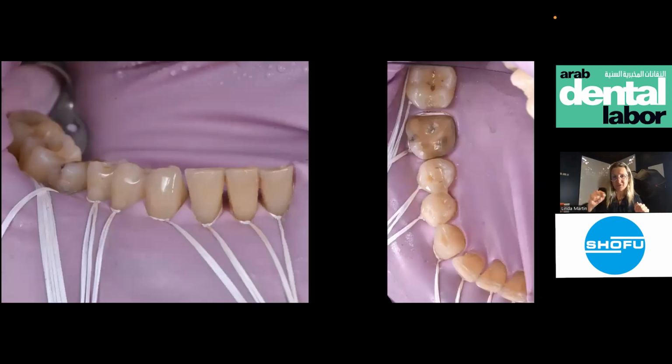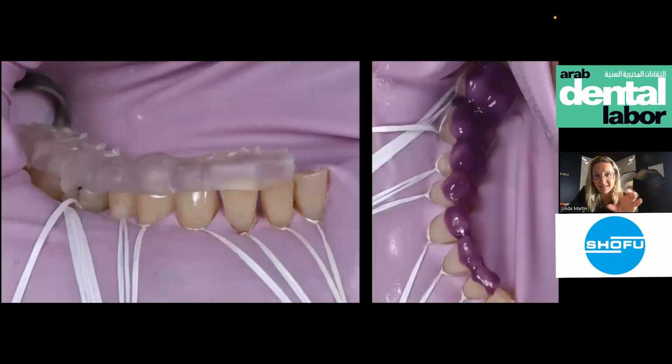For the lower edge, it's really important because we can use the printed keys. Okay. Always with rubber dam. You see, there is a pink rubber dam. I'm a girl, I use pink rubber dam. I love it. So you have the other edge, and you can see the key. I put the key in the middle because it's really, really easier to place. One side by one side.